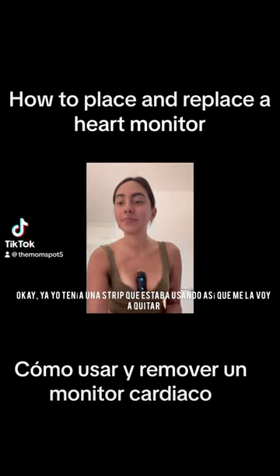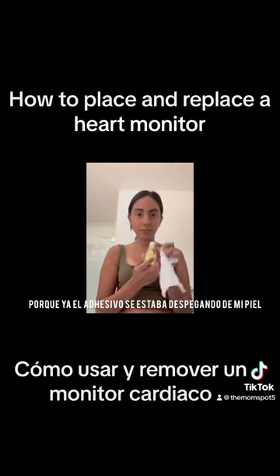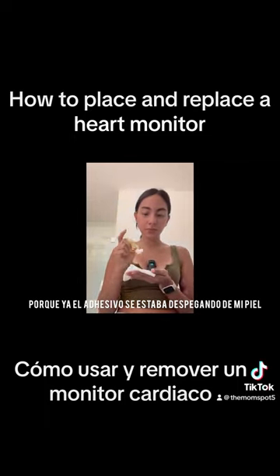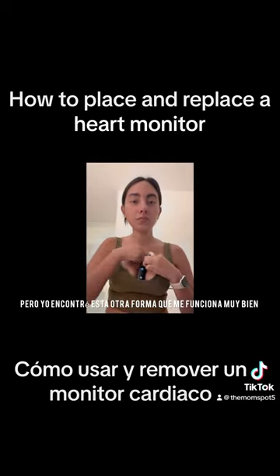I already had a strip and I was going to remove it because it was already getting very loose and it wasn't attaching to my skin. They recommend to shower while you take it off or peel it off your skin, but I found another way that worked really well for me.